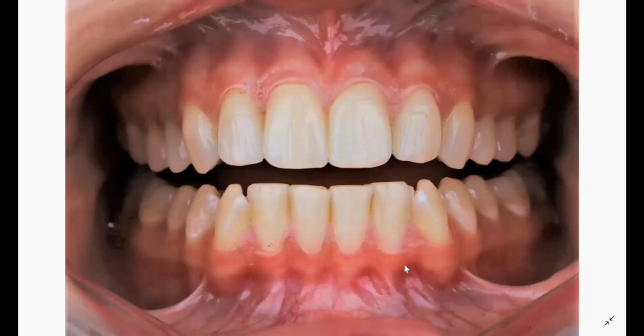The extraoral image should be shot in broad or wide smiling position with maximum display of the teeth and a part of the gingiva if possible. There has to be a small interincisal space, that is, there should be a little gap between upper and lower teeth. Here is one more sample extraoral image. An intraoral image should always be shot using retractors. Again, there should be a small interincisal space similar to the extraoral image.